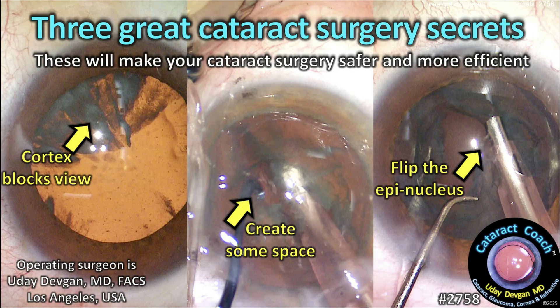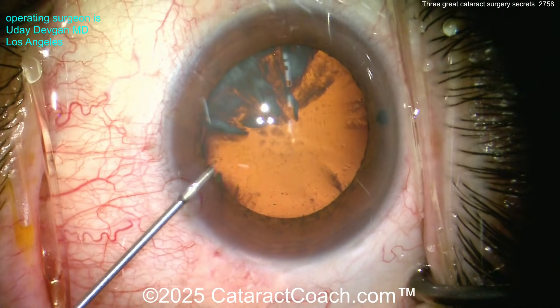cataractcoach.com — three great cataract surgery secrets. These are going to make your surgery safer and more efficient. Three simple things in a very quick video. Here we go — number one.